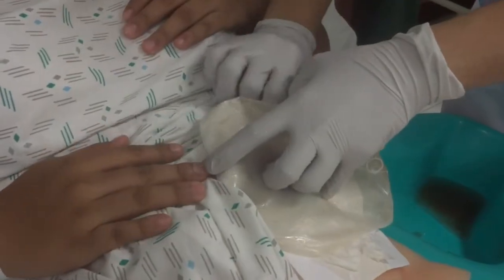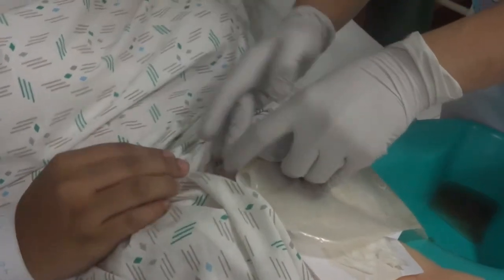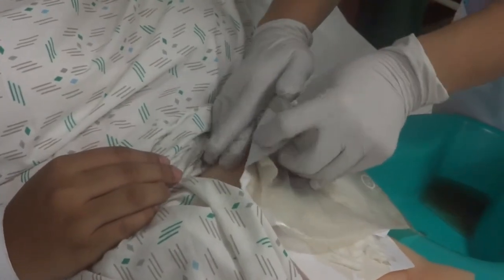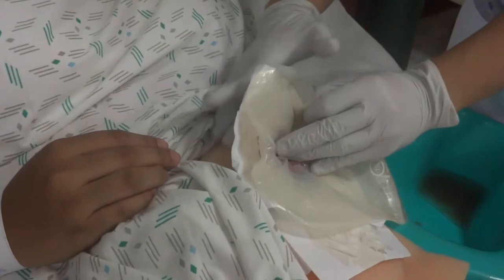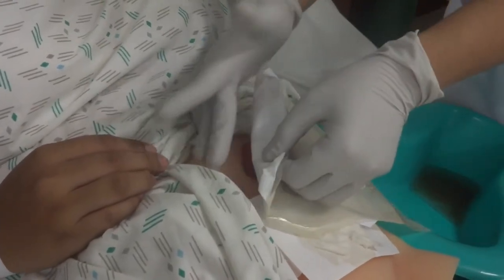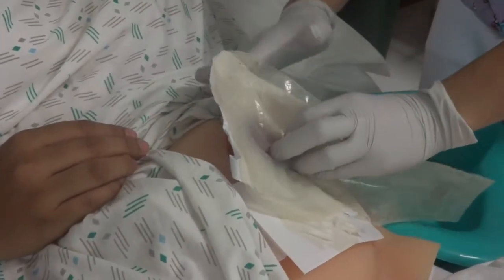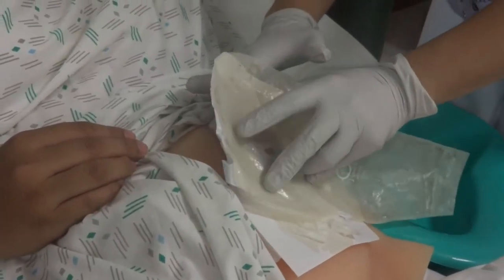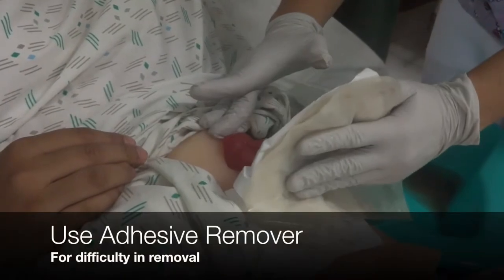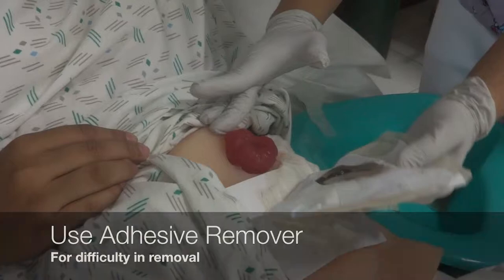With one hand, gently remove the old wafer from the skin, beginning at the top and proceeding in a downward direction. At the same time, use the other hand to hold tension on the skin in the opposite direction of the pull. If resistance is encountered and the wafer is difficult to remove, use adhesive remover or rubbing alcohol according to facility protocol.